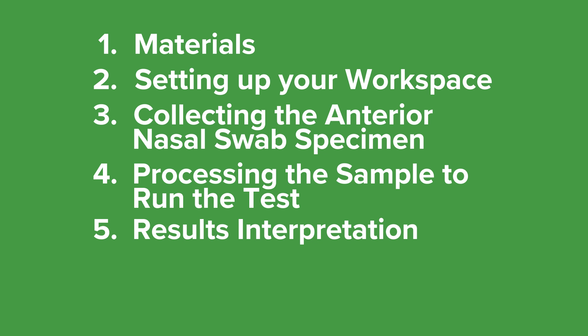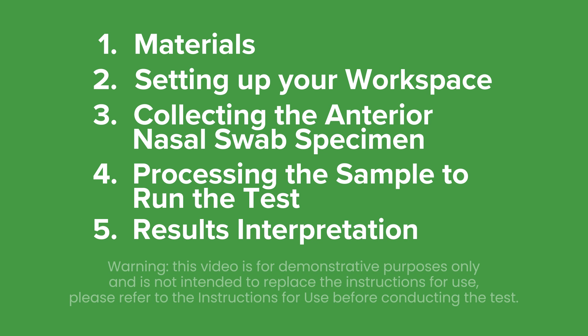And how to interpret the results of the test. Please note that this video is for demonstrative purposes only and is not intended to replace the instructions supplied in your kit box. Please read the product insert before conducting the test.